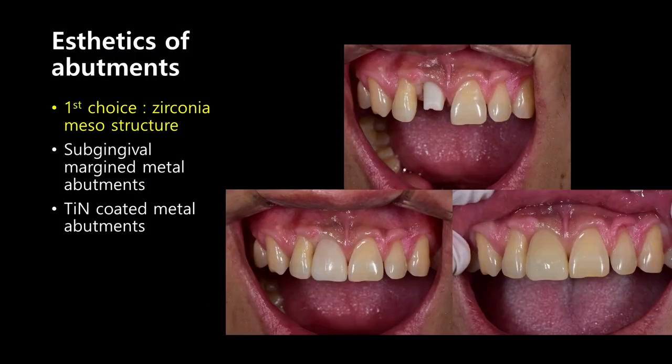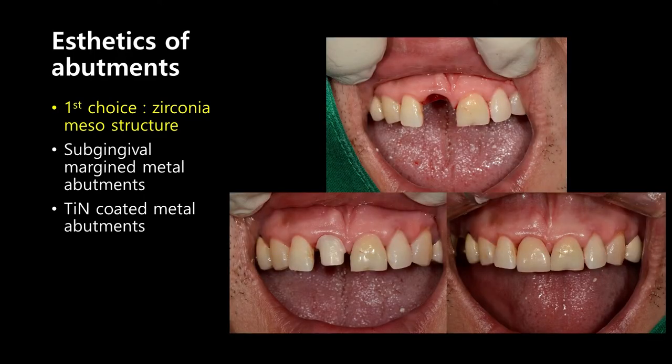Next case. Again, on top of the gingiva, a temporary abutment is used, and on the bottom side, you attach the temporary on the right bottom, its final crown. So the gingiva shadow looks rather natural. And this case is also the same. Here, I did it in my early days, so abutment design-wise, it's not that elegant.